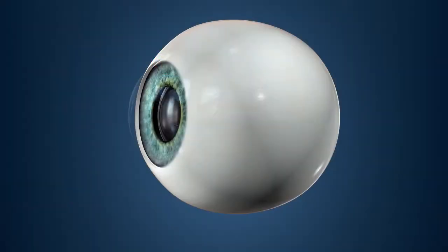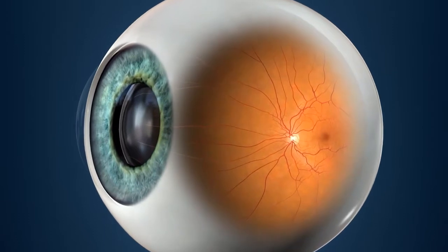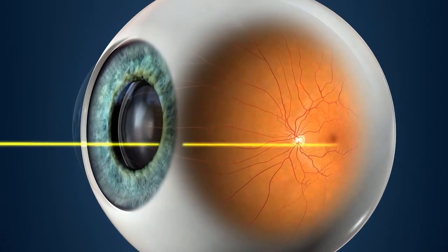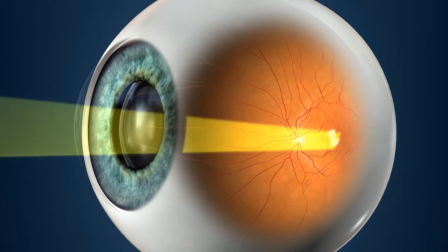All your patient's data is gathered in a single sitting, no longer needing to take patients to multiple devices to gather all of this data needed for a full evaluation. It is achieved in seconds per eye instead of 15 minutes.